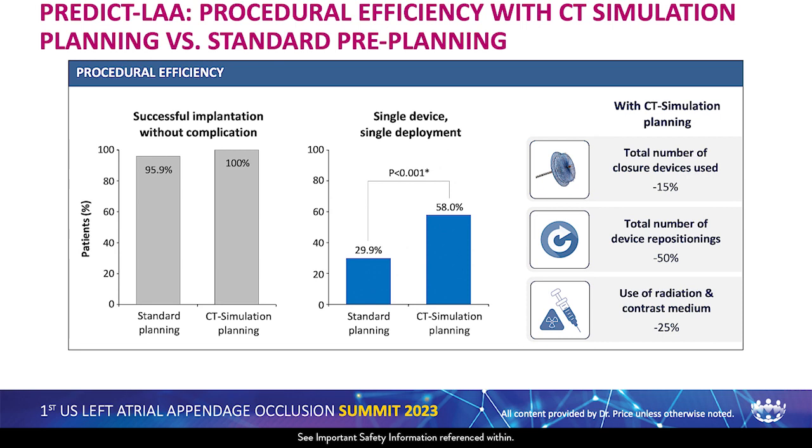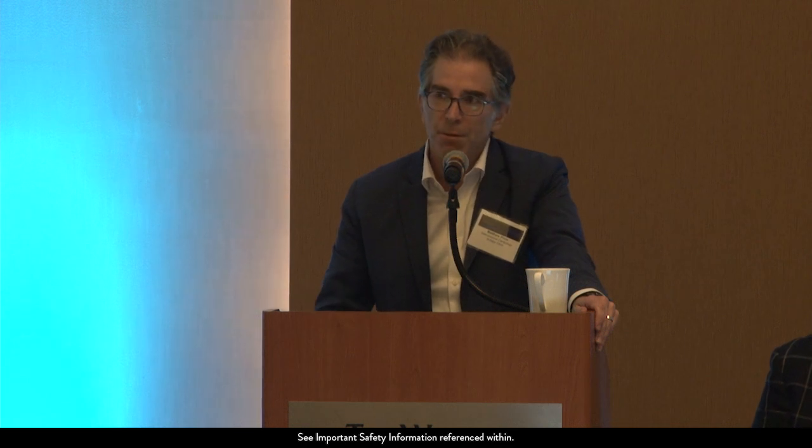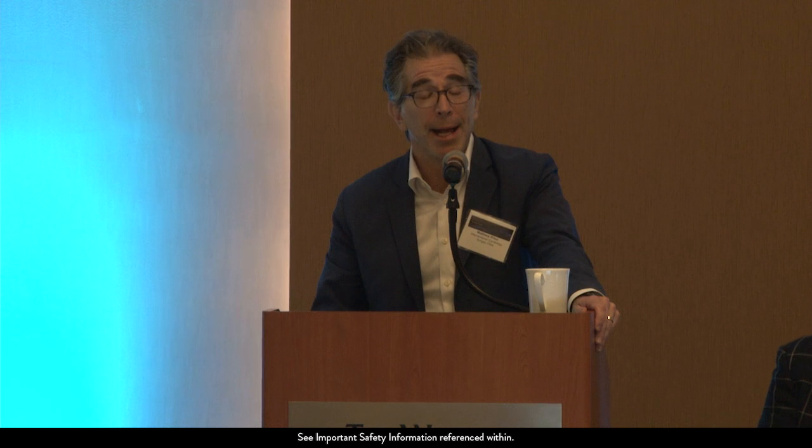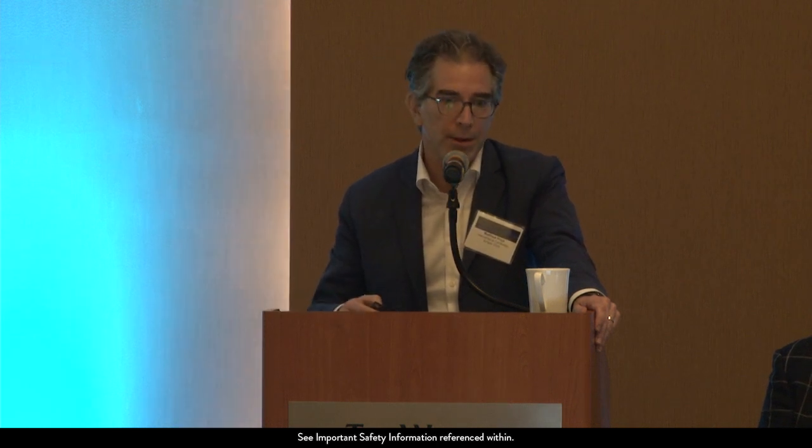And we know that CT simulation pre-planning versus standard pre-planning, mostly CT but some TEE, reduces multiple deployments of devices with the Amulet, improves closure, improves implantation, improves the number of device repositionings, and improves the use of radiation and contrast media. So certainly CT pre-planning, and I think in the future, plus computational modeling, is really important.